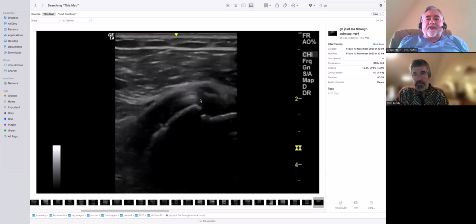But I just don't think we have standards that are good enough to have us go, that looks like it's... I don't think there's a role at all for musculoskeletal scanning of the brachial plexus. I've never seen anything useful when I've looked at it. If I saw a mass in the area, maybe, but that's a 1 in a million. That's a unicorn, even by my standards.